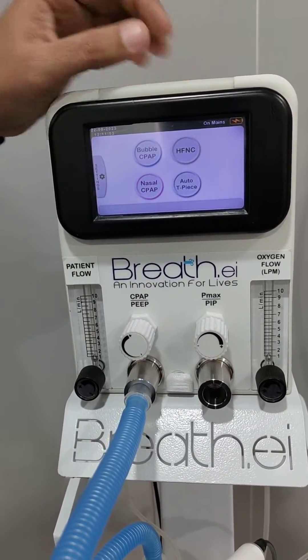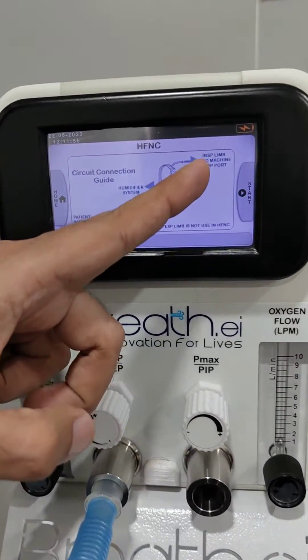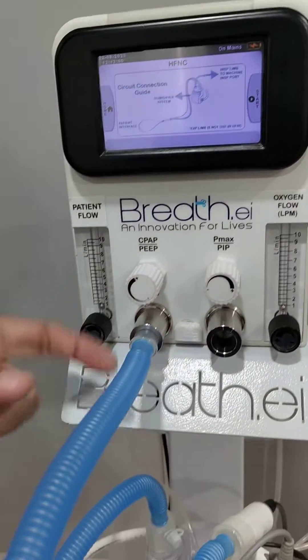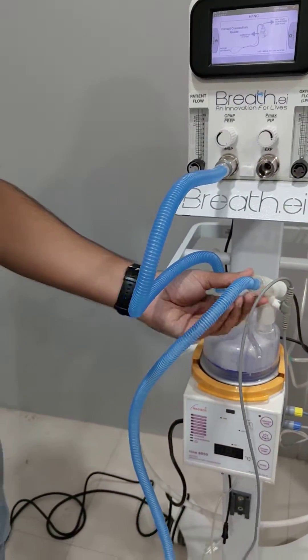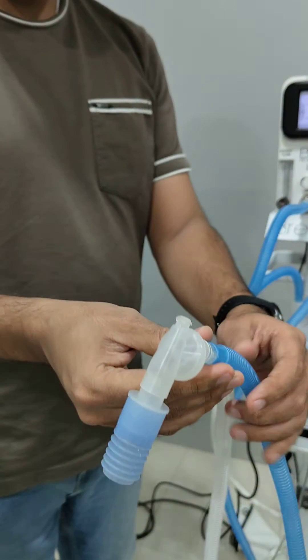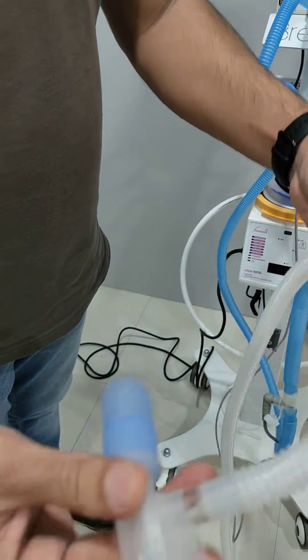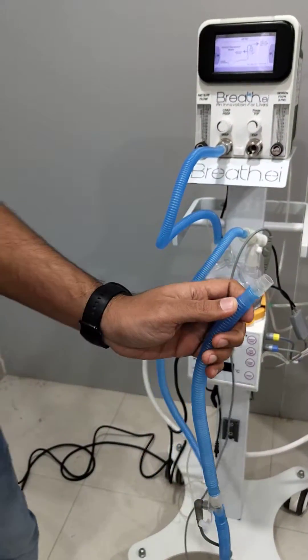We are showing a demo for HFNC mode. First we have to start this HFNC mode and connect the circuit as required — connecting the inspiratory limb to the humidifier chamber. From the humidifier chamber we go to the Y-piece. For HFNC we do not require the expiratory limb, so we remove it from the Y-piece.